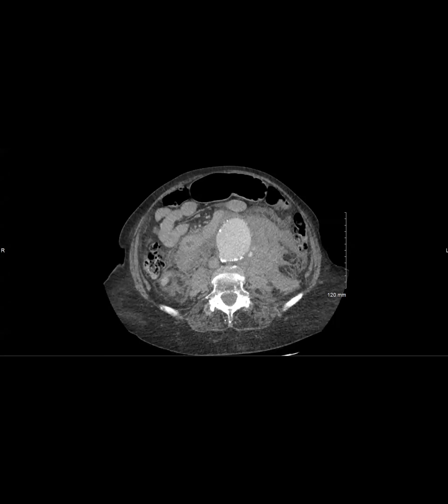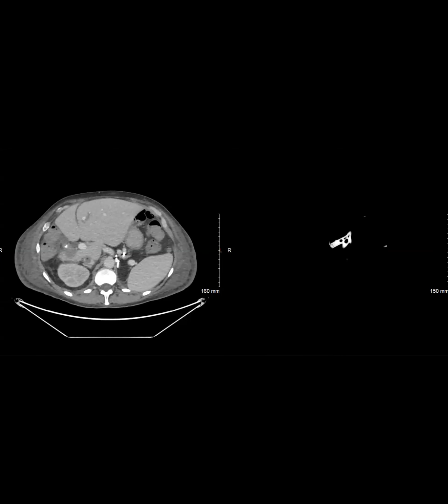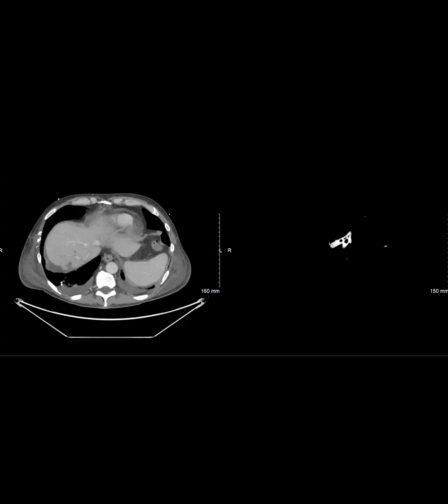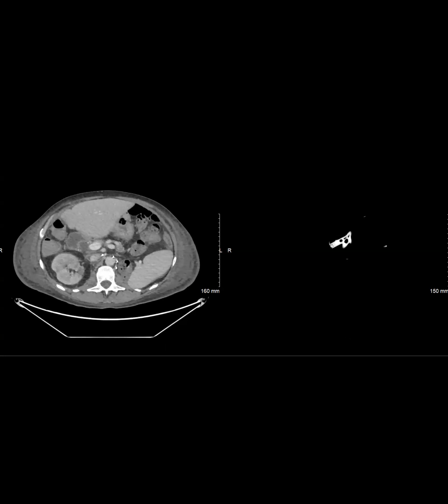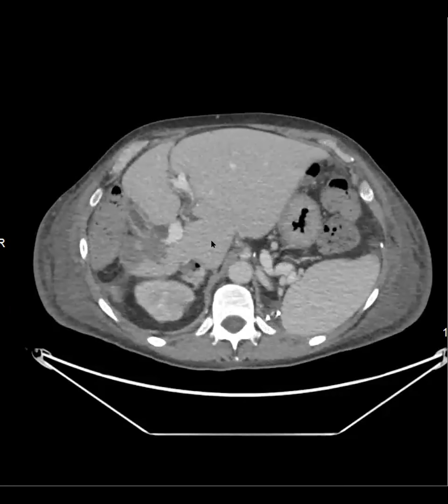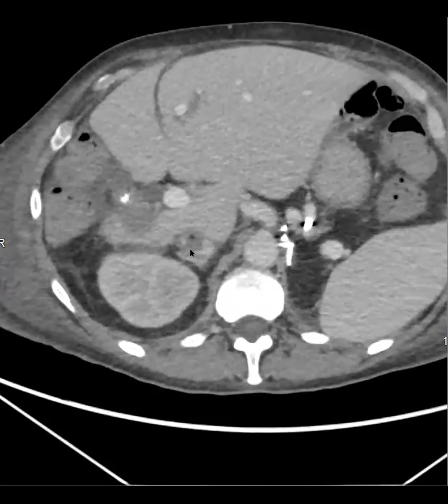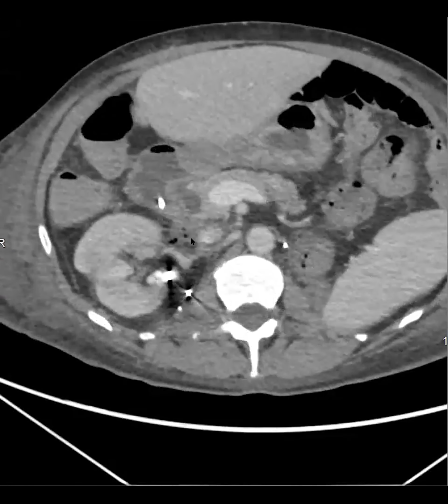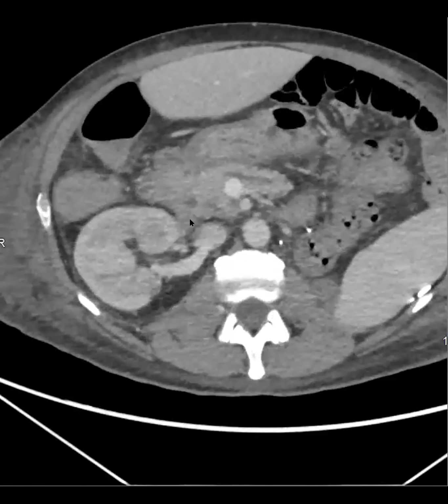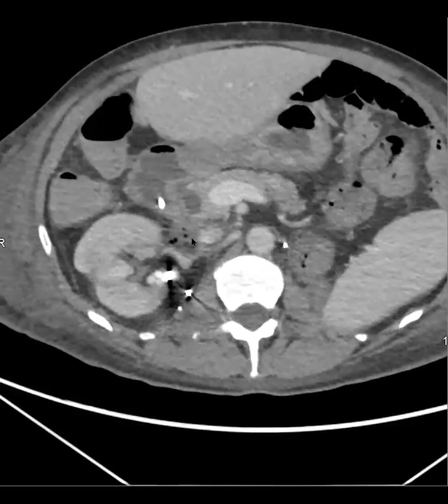Okay, and the final case I have is, so this is a very interesting case. The patient had an original tumor. He had, I think, RCC. Yes, RCC. And he presented with, I'm just going to, they did the study because they were concerned about duodenal perforation. So what you see is a thrombus in the IVC with foci of air. And as you follow it down, you can see it right there, that it communicates with the duodenum here, like peripherally. So this is a duodenal-IVC fistula.